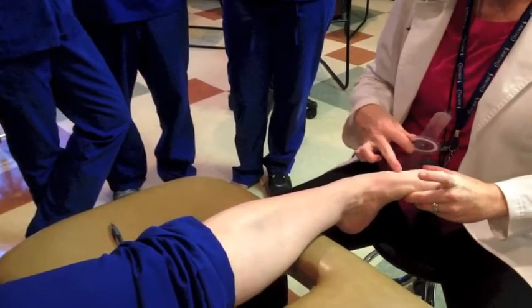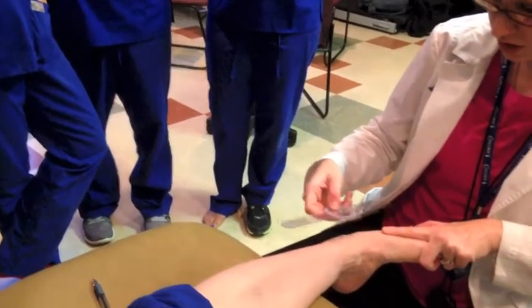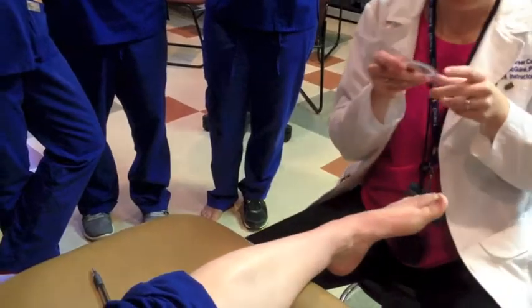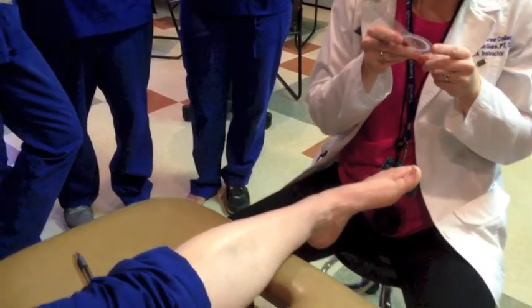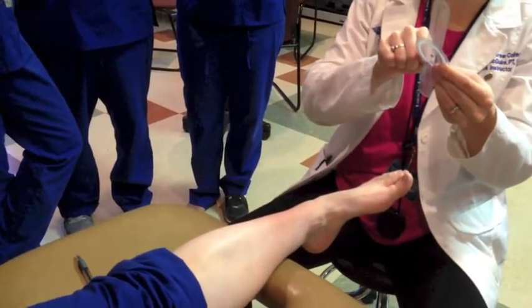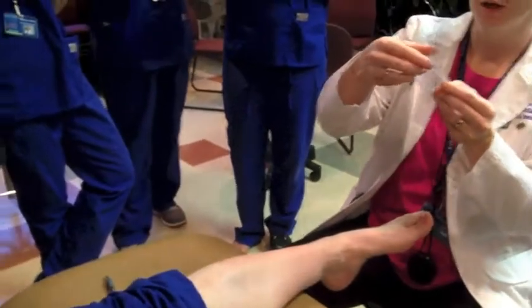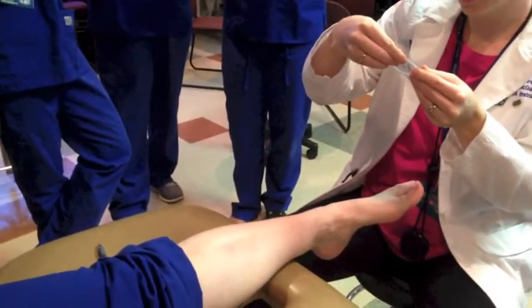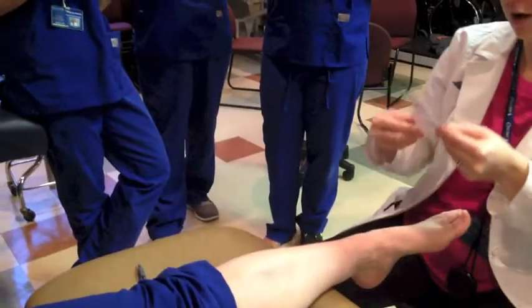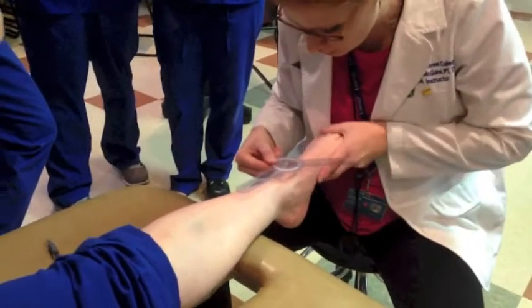Where's that second metatarsal? It's about right there, and my fulcrum is here. I'm going to say that's a little past 45 at least. Now our zero is up here because if you look down here it's 180. Make sure to look closer to the stationary arm — I'm going this way. So I'm going to say about 45. Let's see what happens. I'll line up my fulcrum and my stationary arm and then invert her.